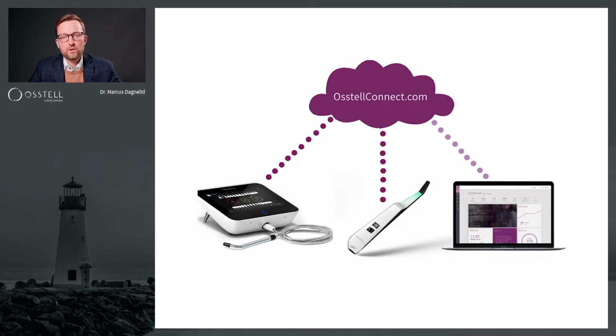But nowadays we're only utilizing the Osstell beacon, which is really a straightforward, intuitive way of delivering the ISQ values. And by means of Bluetooth, it connects to the computer and brings up the different values for each patient to the Connect platform. And this has really made the inclusion, I think, in terms of my dental assistants, because they are controlling the platform, they are adding the patients, they know exactly what we're going to do.